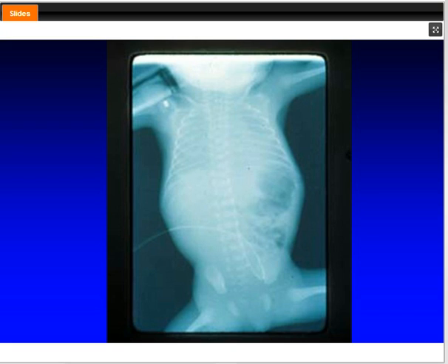And again, how do you choose that? Well, if this baby was on a conventional ventilator with as white as this lung is and as poorly inflated as it is, one would argue that you probably needed a mean that's a little bit higher than 1 to 2 above. But once you initiate it, you gradually increase it until you see improvement in oxygenation.